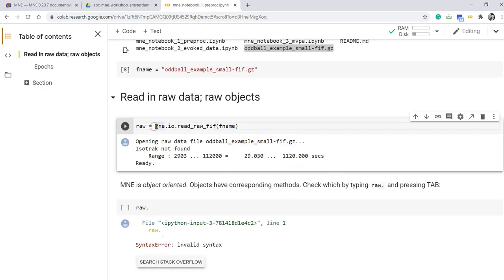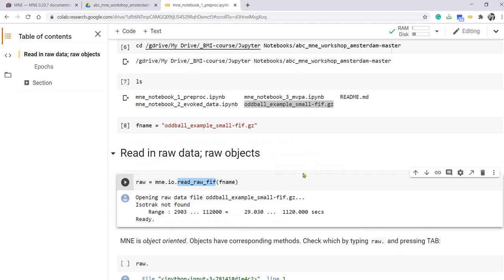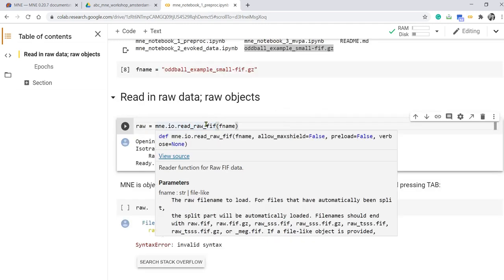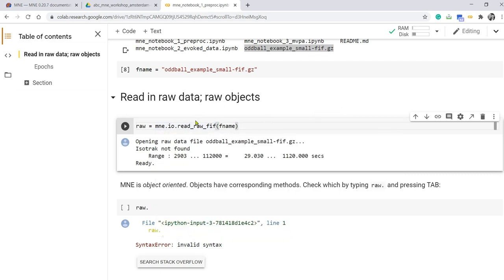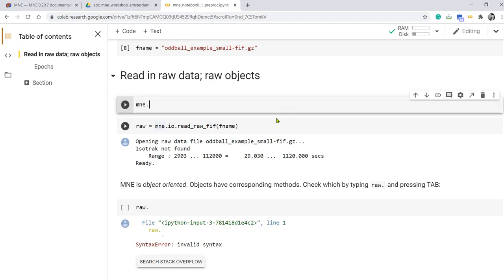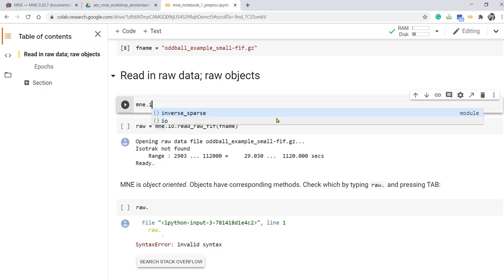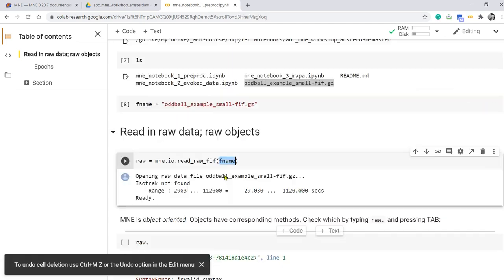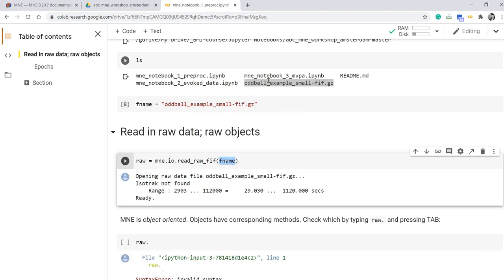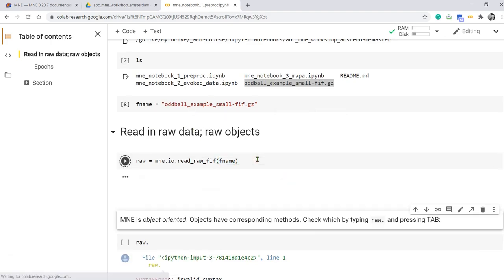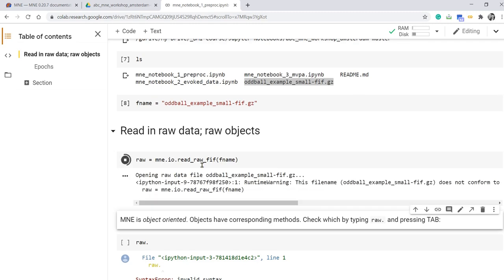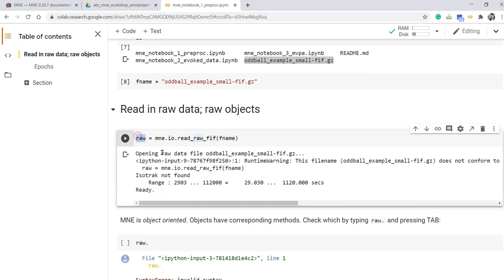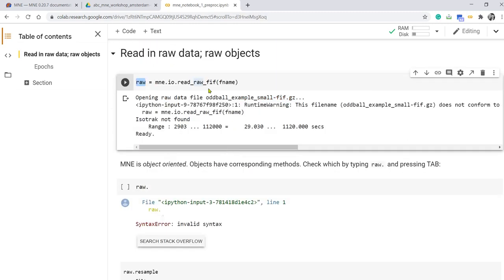Now we can see what I have in my current directory. So these are the files. So I want to load this file. This is ERP. And I call it as fname. We have already imported MNE. And then some other useful functions that MNE has is reading different types of files. Different files with different file extensions recorded by different EEG, MEG devices. So MNE module contains input output functions that allows you to load data. So this is the name of the file that I want to load from this directory. So let's try to load it raw. So you see, we have raw data loaded.